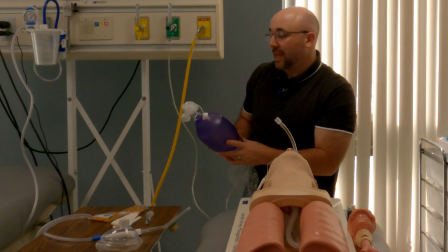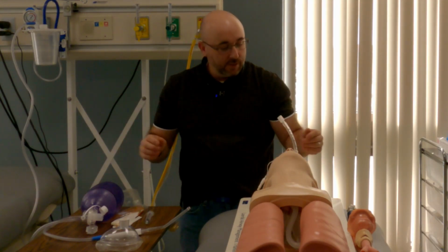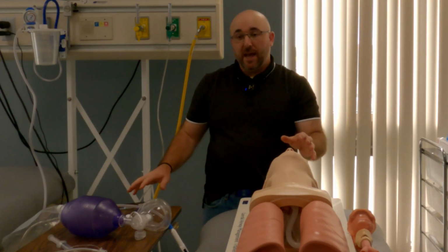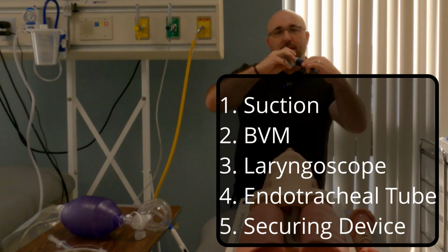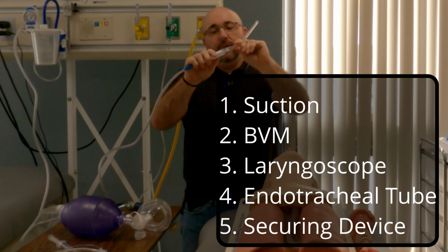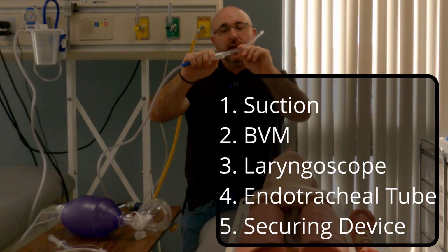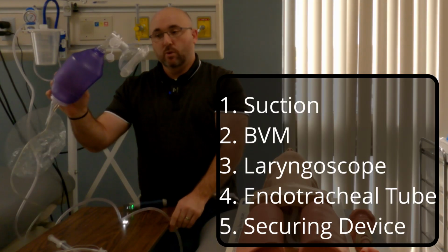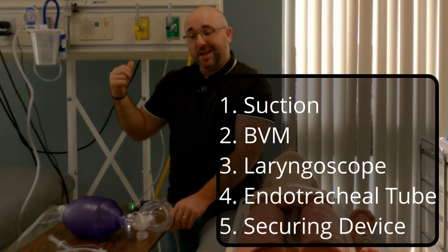So let me go back through that real quick just to show it one more time. Okay, 5 items we have as a review. Laryngoscope blade and handle, light works. Suction and a rigid tip or Yankauer, full suction turned on. Bag valve mask, with the mask attached, oxygen running at 100%.